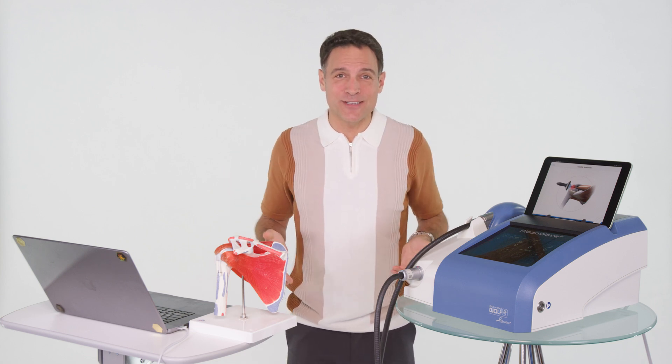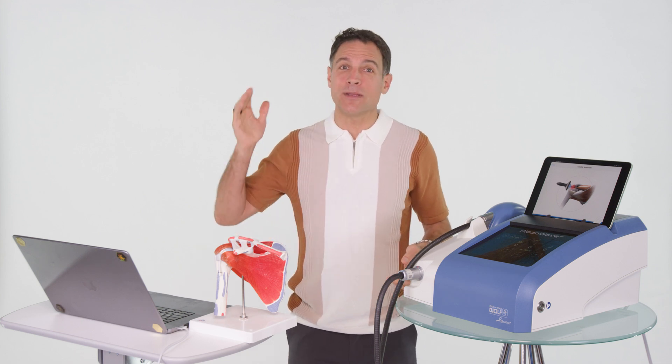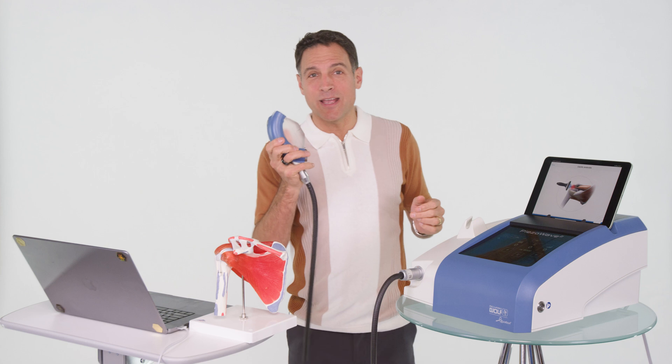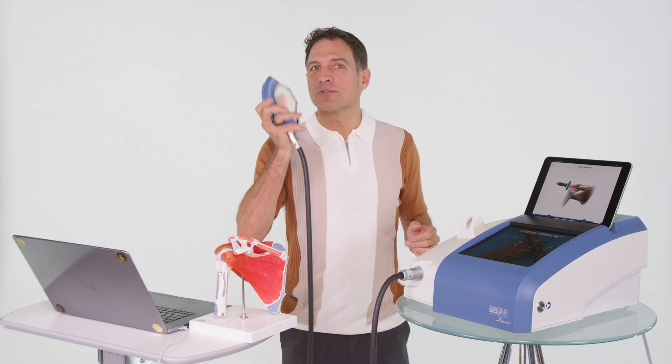I'm Dr. Adam Fields. I'm a chiropractor. I work with manual therapy, shoulder stabilization exercises, and the piezo wave to prevent you from needing a surgery.